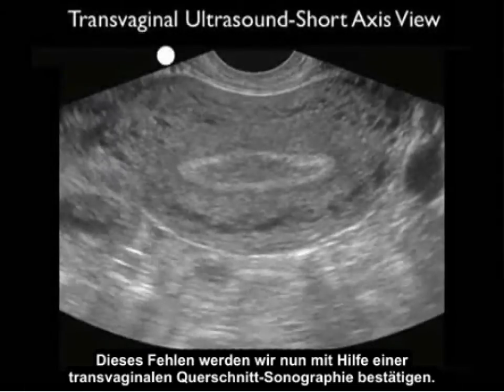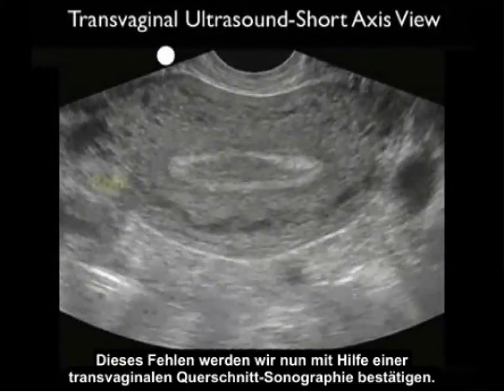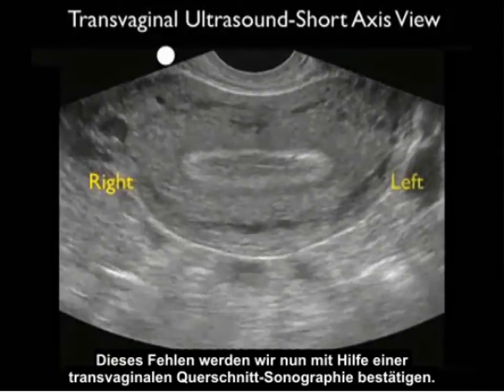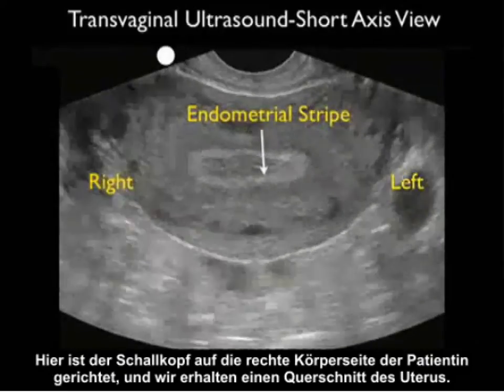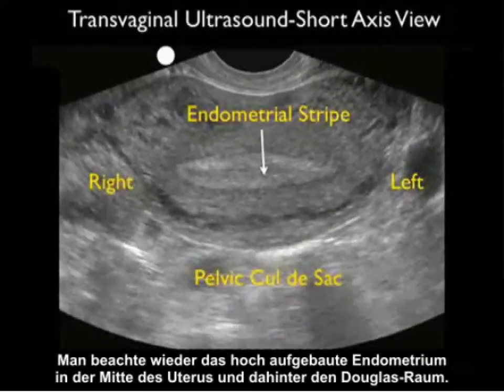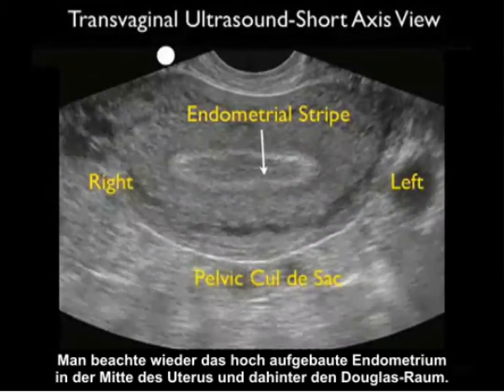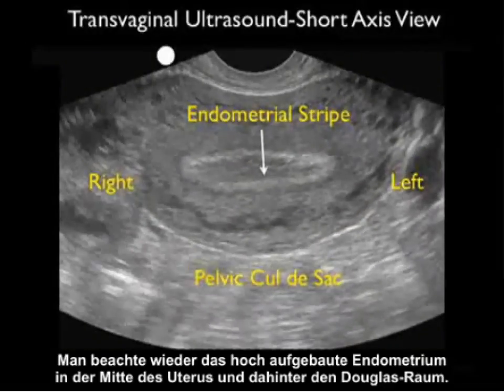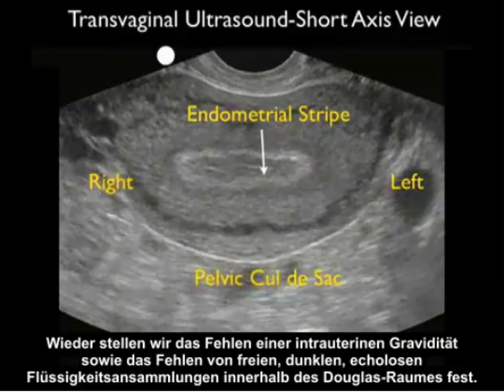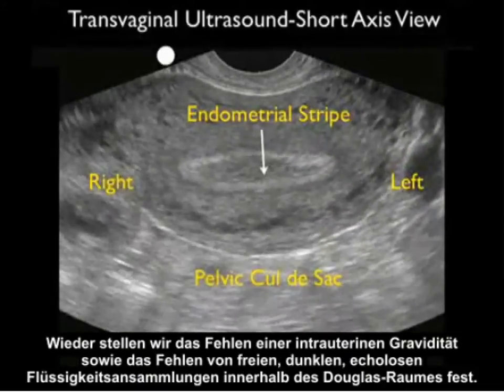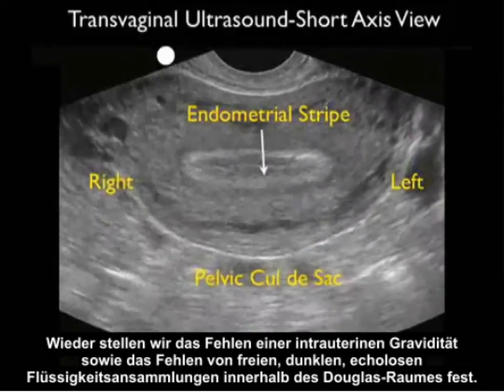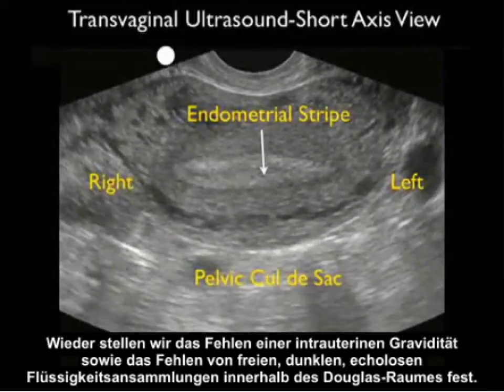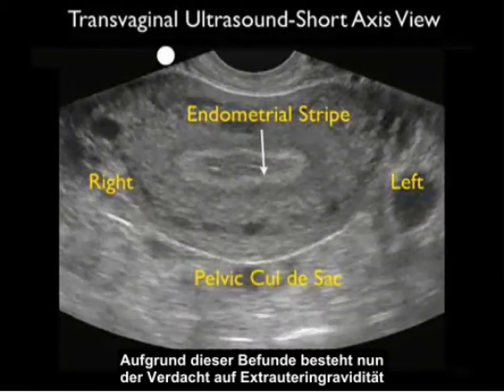Now we'll confirm the absence of an IUP by scanning in the transvaginal short axis plane. The probe marker is oriented towards the patient's right and we're cutting the uterus in cross section. Notice again the thickened endometrial stripe in the midline and the pelvic cul-de-sac posteriorly. We again see the absence of an IUP and also note the absence of free fluid — dark anechoic fluid collections within the pelvic cul-de-sac. Given these findings, we're now concerned about the presence of an ectopic pregnancy.